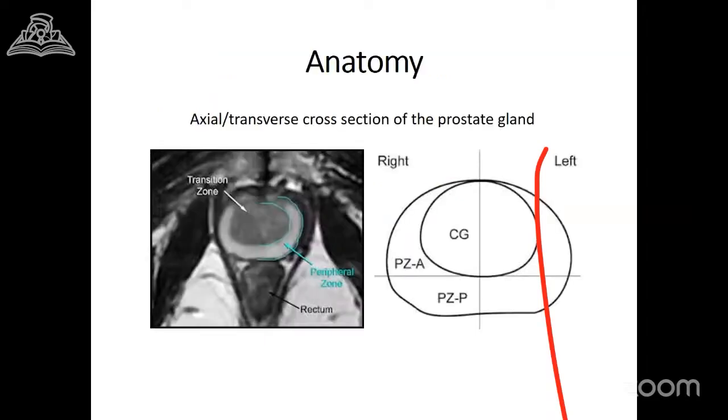So how does the normal gland appear? The normal prostate gland on MRI shows a well-defined symmetric structure with preserved zonal anatomy. On T2 weighted images, the peripheral zone appears relatively high in signal intensity, while the central and transitional zones show lower and more heterogeneous signal.